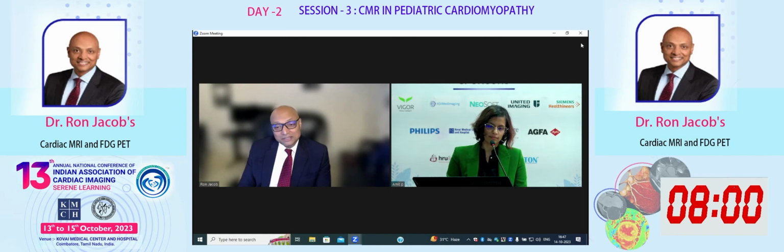That's really interesting. Usually the VT is mediated by the LGE, the inflammation not so much, but you can get conduction blocks depending on where the inflammation is. So it would be interesting to follow that up with a repeat CMR. What did you do for treatment? Did you put him on immunosuppressives? Yes, he is on immunosuppressives. It would be interesting to repeat the CMR in about 6 months or so, and see if something changes. Yes, we'll get back to you on that.